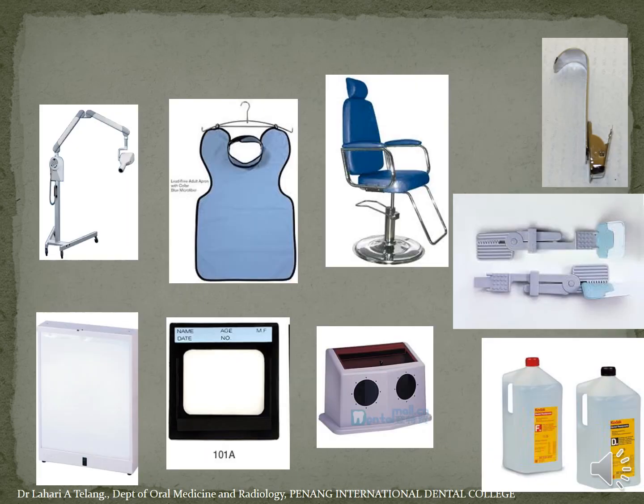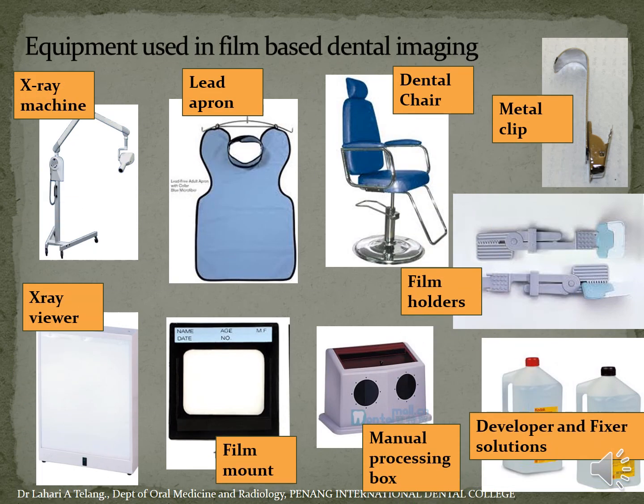So now, when you're actually doing radiology with film-based imaging, there are a lot of items or equipment that are used.